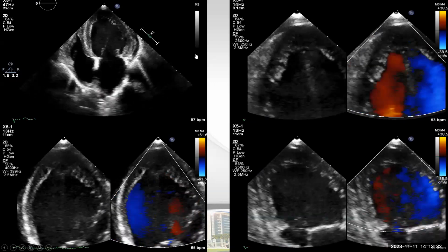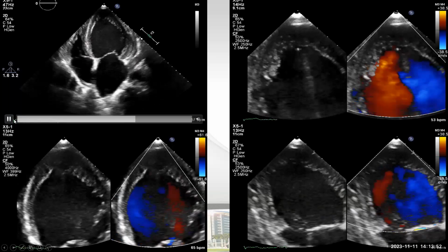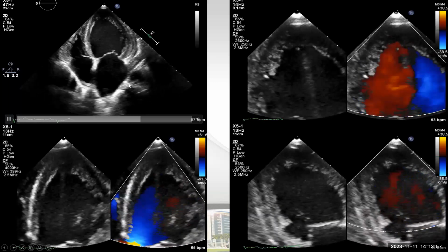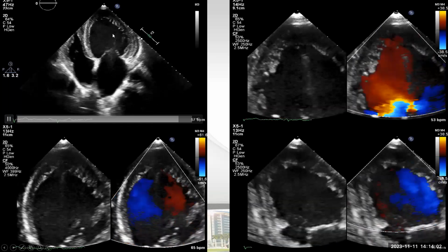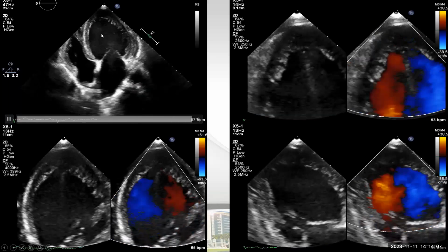Let's see the answers. Dilated cardiomyopathy. Okay. Tethered mitral valve. LA dilated, severe dysfunction. So somebody said this is non-compaction. LV non-compaction. Why did you say non-compaction? Please, can you write? It is very clear that we have a dilated left atrium. You can call this a dilated left ventricle. The RV, you said, is normal, and there is significant systolic dysfunction of the left ventricle.